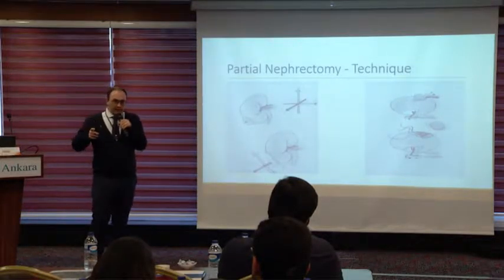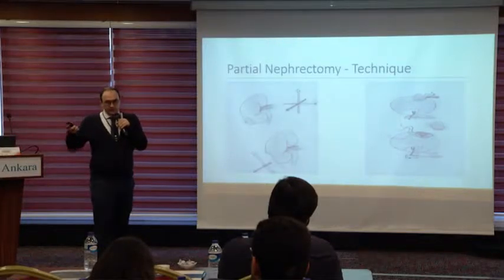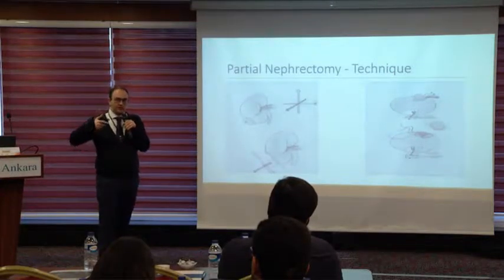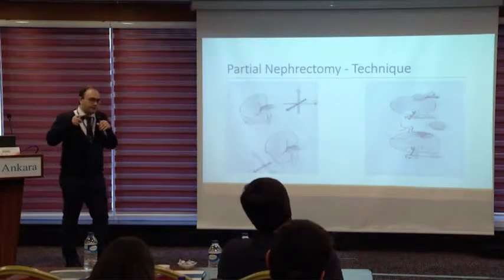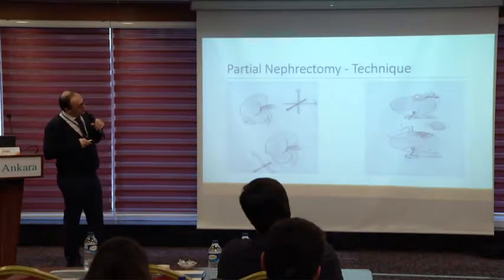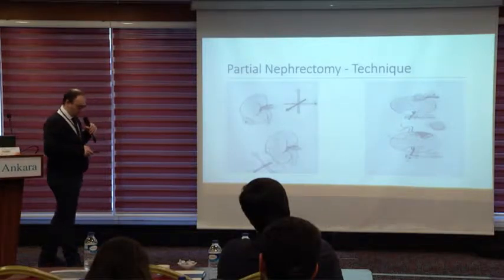So laparoscopy is a master-slave system. You are the master, you see your movement in 2 dimensions, but your movement has a reflection in the 3-dimensional world. And we have another technique which comprises pre-positioning the needles under the mass, and during resection, forwarding the sutures and making a resection at the same time. I think this is very feasible, very beautiful, but I did not perform this technique.